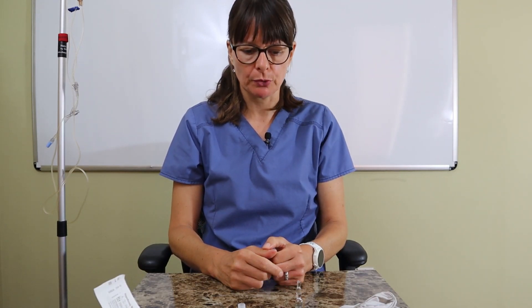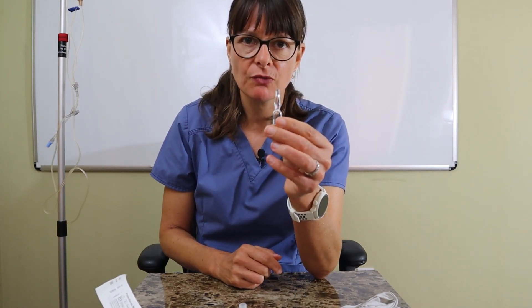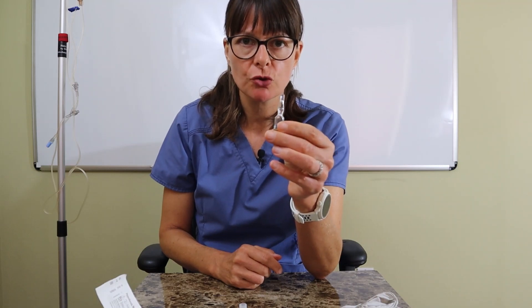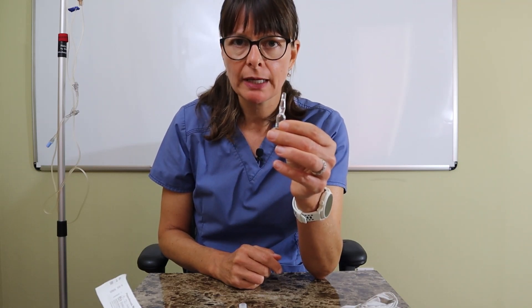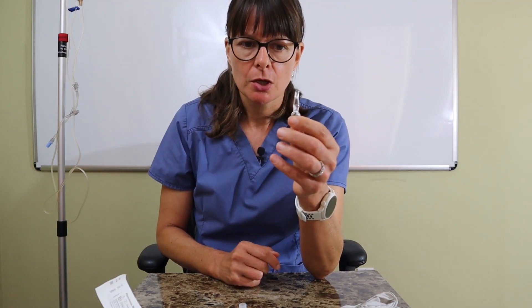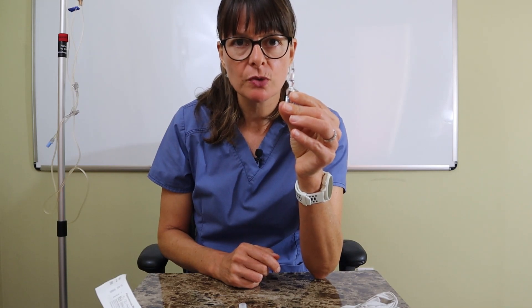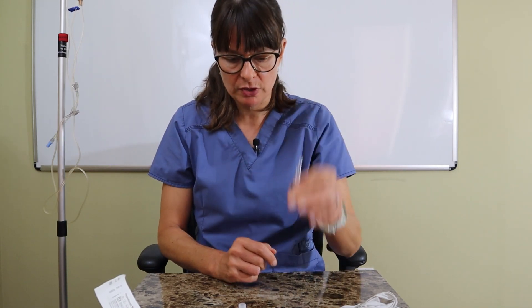Welcome to Nursing School Explained and this video on how to draw medications from an ampoule. Ampoules are rare now but certain medications come in a glass vial because the medication is not compatible with any kind of plastic tubing or vial. It looks a little bit different and is made out of glass, so there are a few extra safety precautions we have to take.